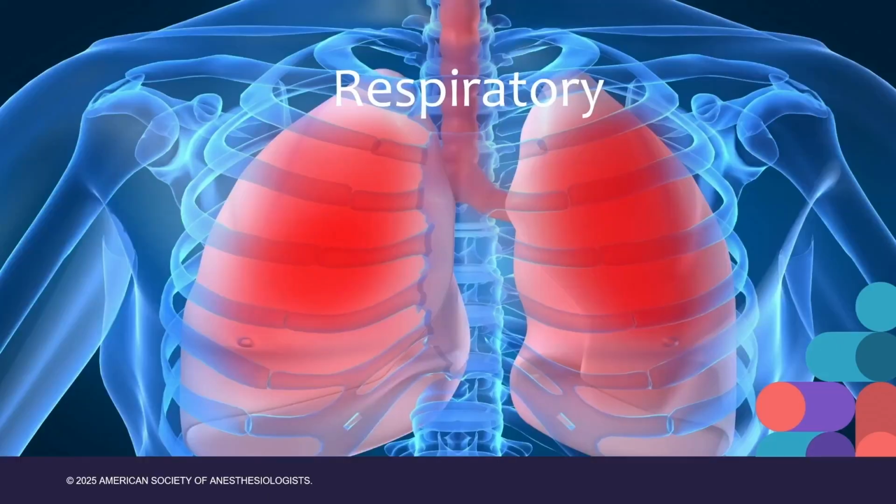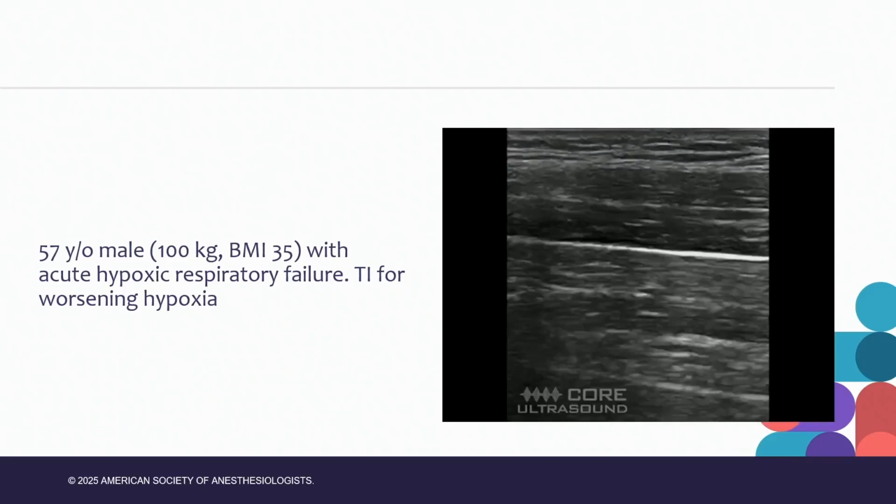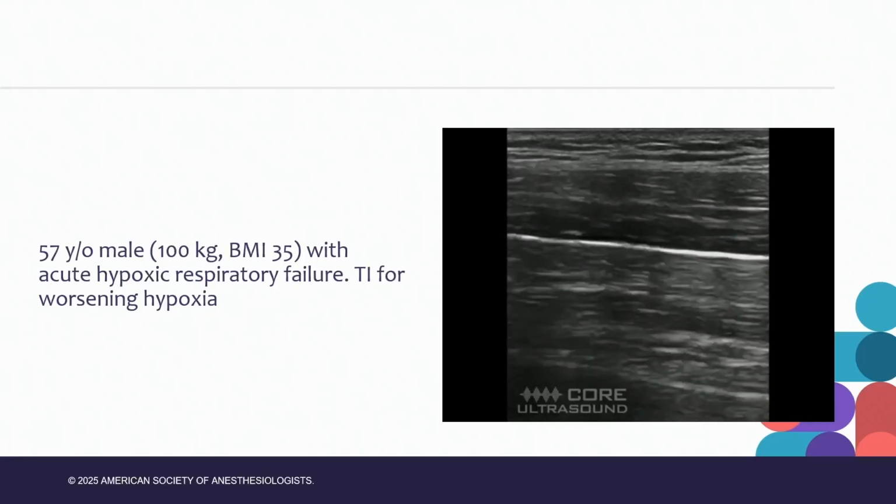Let's look at a few respiratory examples. I think Rachel talked about these for undifferentiated shock states as well. But this is a similar patient, a hypoxic patient that you want to intubate. You do a lung exam and this is what you see, right? This is a lung point. Patient has pneumothorax. There's two problems here, right? One is maybe this pneumothorax is the reason why this patient is in respiratory distress. And if you address this, you may not have to intubate.